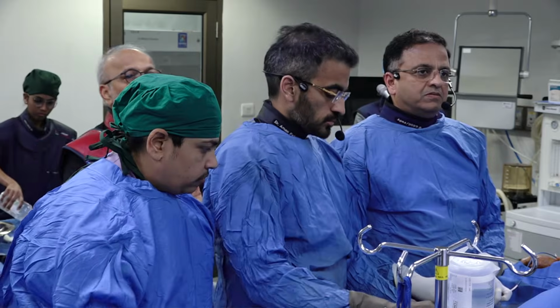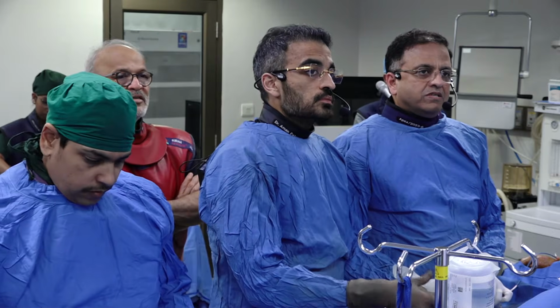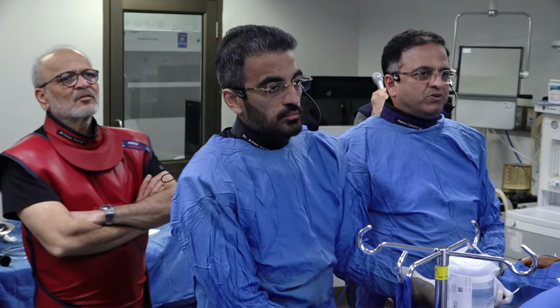Good afternoon. Can we have the stent size? I think we are live already. Yeah. It was put in 2020.